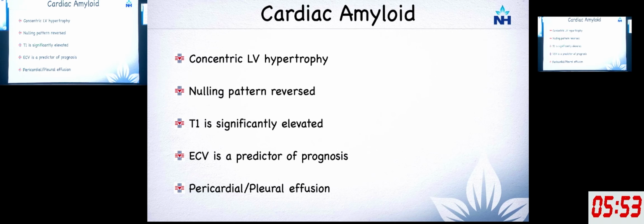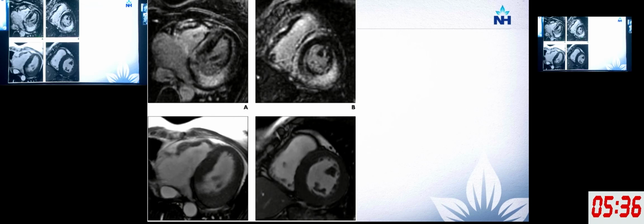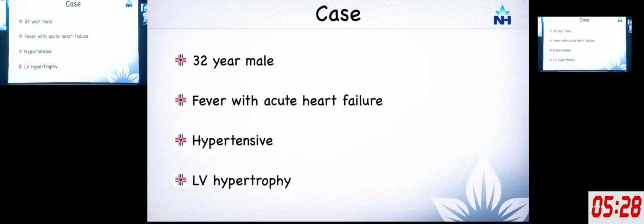Because I was trained in a place where the techs knew what they were doing, I'd left it to them. And then when I went and asked, I realized I didn't know what I was doing. So we called all the 3. None of them were amyloids. So it's very important that you know your technique and get it properly. You can get atypical presentations, or these are kind of described presentations which can confuse you, but look out for pericardial effusions and pleural effusions in these patients.